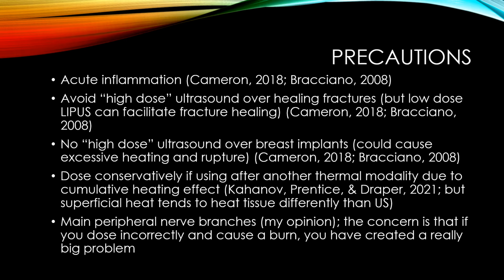A final precaution, and this one is really my opinion, is that you want to be really careful if you're going to apply ultrasound over a main peripheral nerve branch. My concern here is that if you dose incorrectly and you cause tissue damage, you've created a really big problem if the tissue that you have damaged is a main peripheral nerve branch.